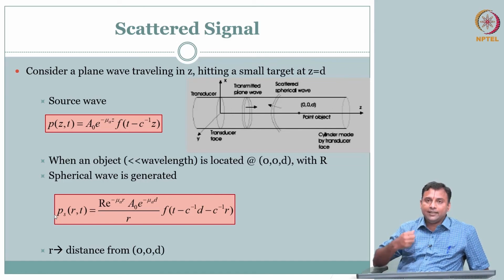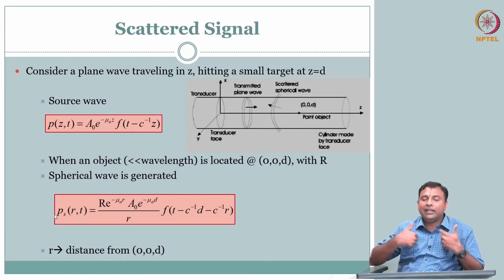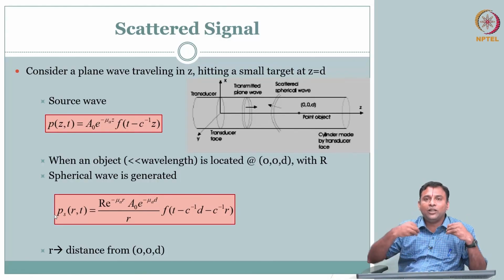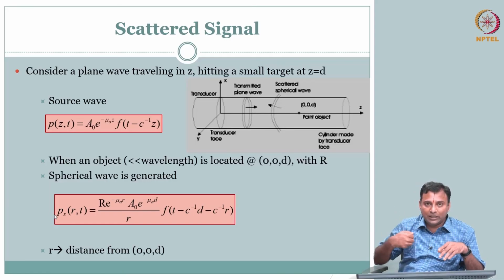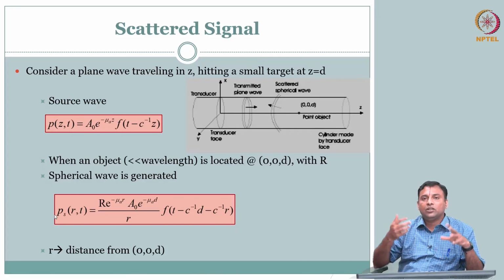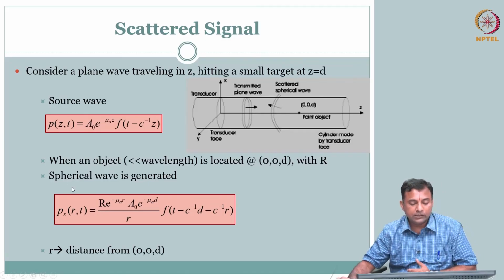So the whole idea here is I send a sound signal that gets bounced back because of the material property, how the material is distributed, how the acoustic scatterers are distributed in the body. Based on that, I get my echoes back. I send the acoustic pulse, I get echoes of that pulse. So typically we operate in what is called pulse echo ultrasound imaging. This reflected or scattered signal, whatever you get, is the echo. So this is how you can write that.